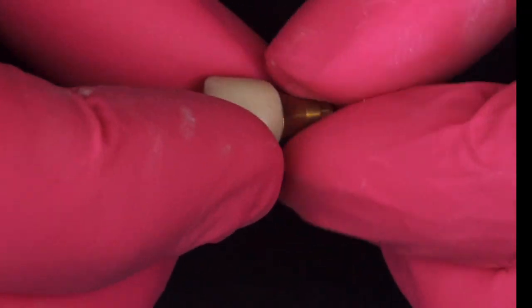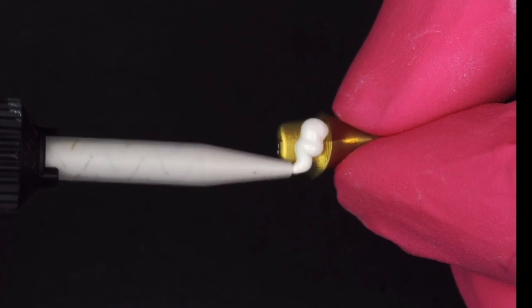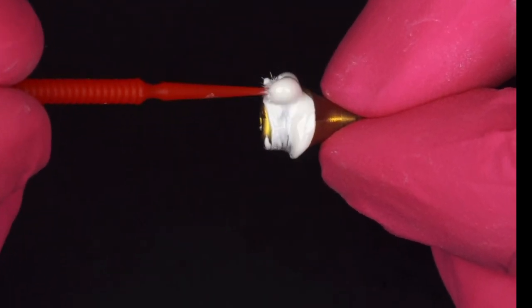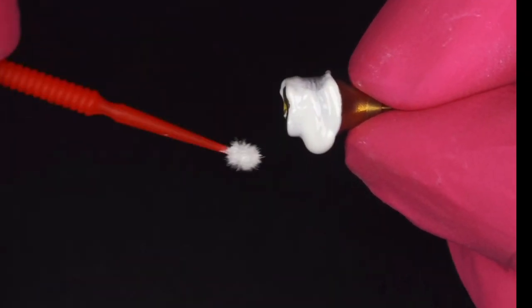I'll show you what happens when you do. All right, let's do this. This is a molar tooth number 19 here. Again, Ivoclar abutment cement. I like that it's opaque because it kind of hides the gold a little bit, especially in the anterior zone. It's a super thin coat, but I love this stuff. I've not had one debond and I've done hundreds of these things.